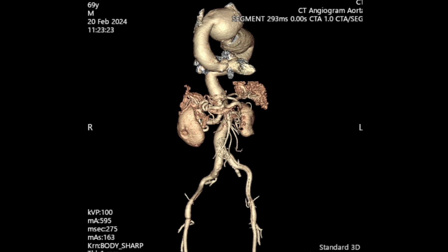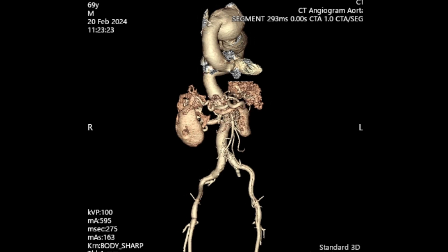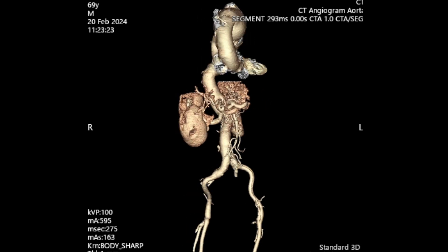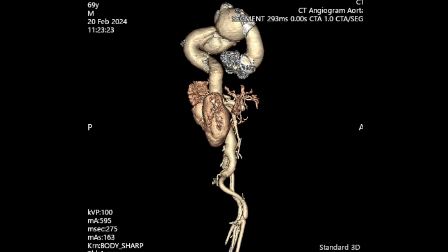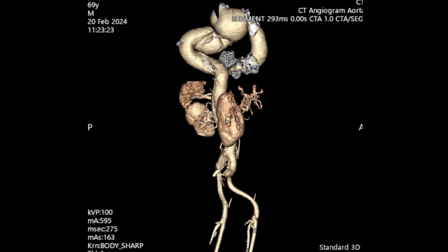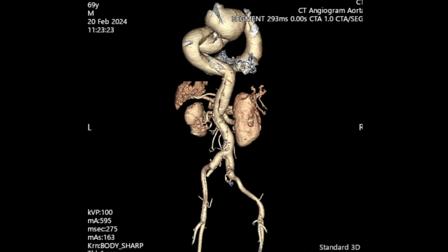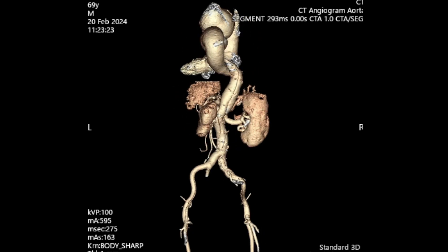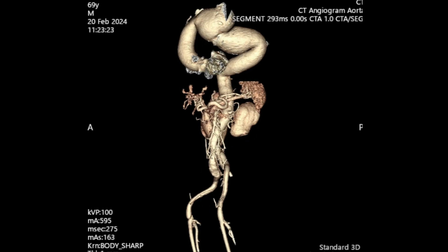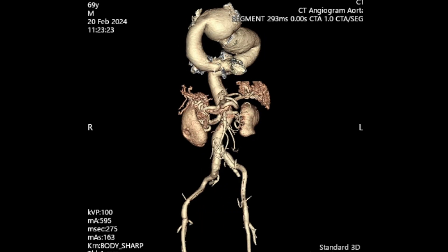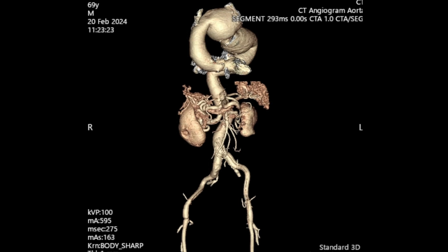Under a brief period of circulatory arrest, I'm hoping to clamp the neck just distal to the subclavian artery. The aneurysm is so big it will be difficult to place a cross clamp without circulatory arrest. Distally, I'll clamp the descending aorta just beyond the aneurysm with a separate perfusion cannula to perfuse the visceral organs.